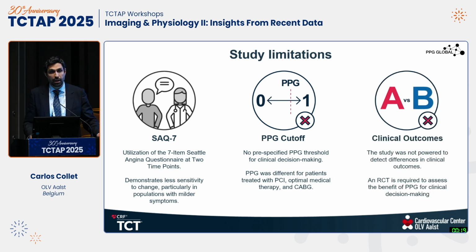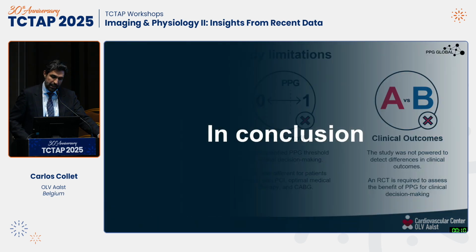And we powered the study not for clinical outcomes. We powered the study to assess the capacity of PPG to predict post-PCI FFR. So we would need, of course, more patients to look at clinical outcomes.